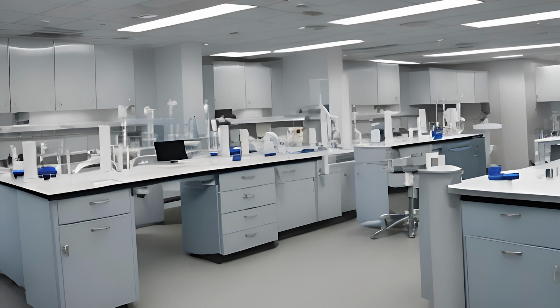Your label, at a minimum, will include your patient's first and last name, their identification number and date of birth, the date and time you drew the blood, your initials as the phlebotomist, and if there's any additional required information, such as if they were fasting.